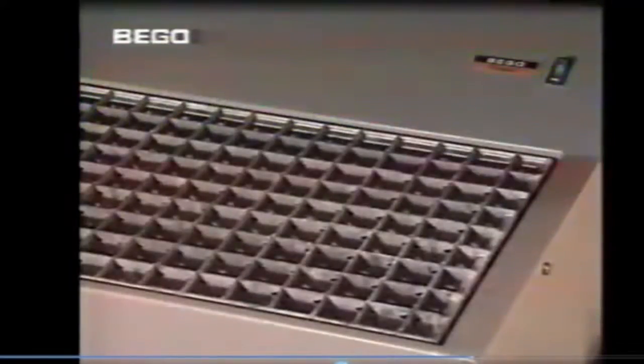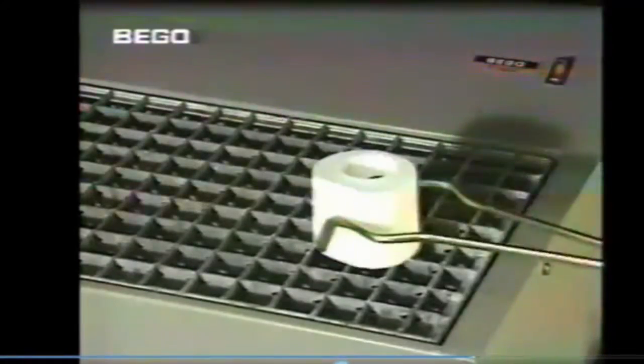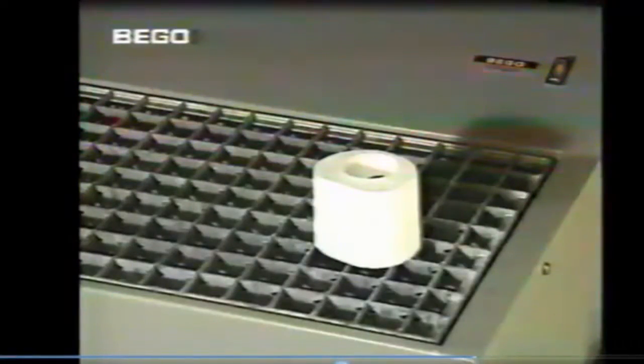Whatever the casting technique, the muffles must be cooled slowly to room temperature after casting. This avoids inducing stresses in the metal as a result of cooling too quickly. Only muffles that have cooled down completely can be immersed in water to avoid dust during deflasking.